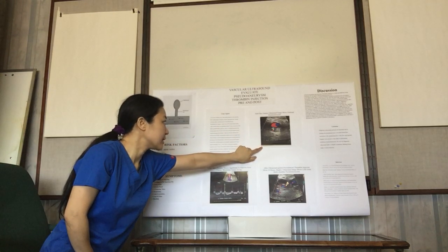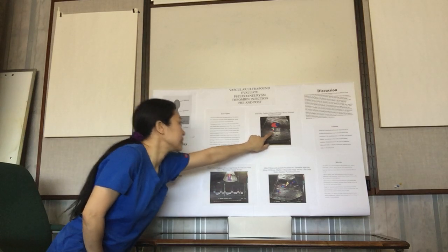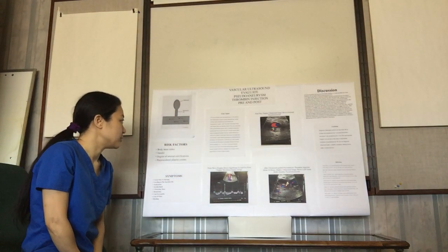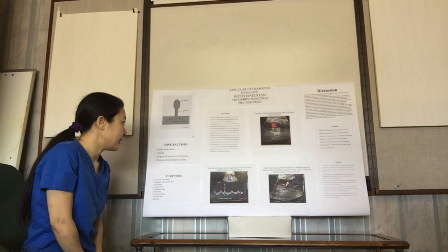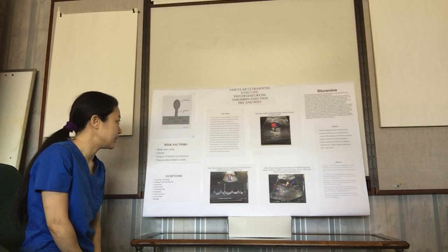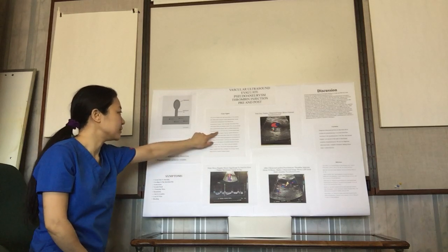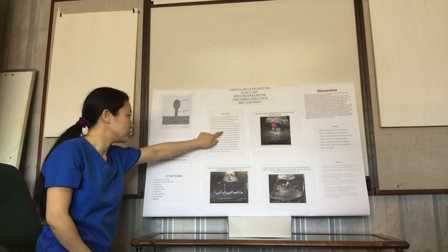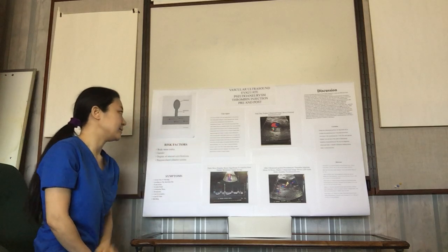This figure demonstrates the first day duplex ultrasound image showing the femoral pseudoaneurysm, and the ABI is moderately reduced. After she got a successful duplex-guided thrombin injection, there is a resulting hematoma that measures 5.7 centimeters times 2.7 centimeters times 5.9 centimeters. The ABI didn't change.